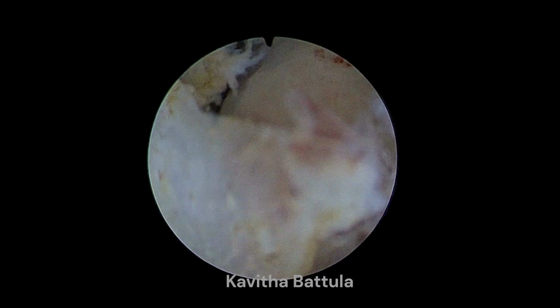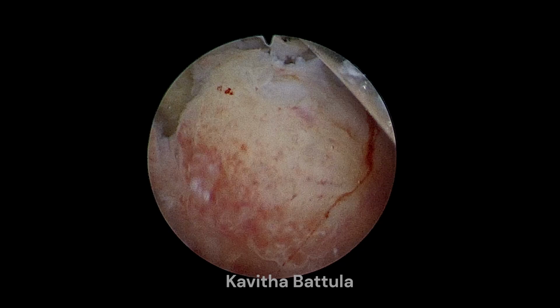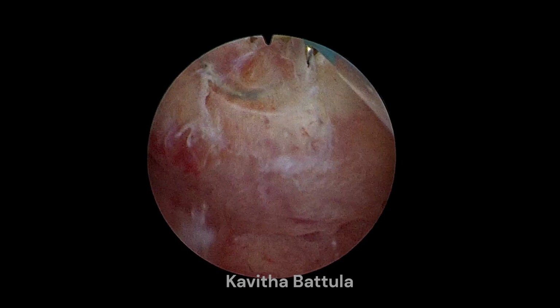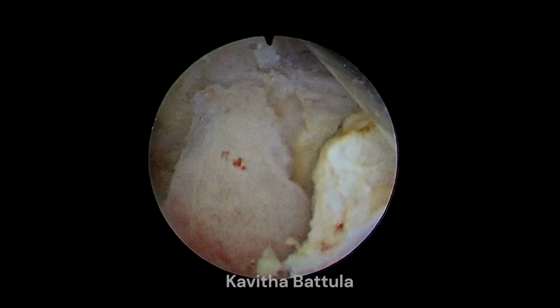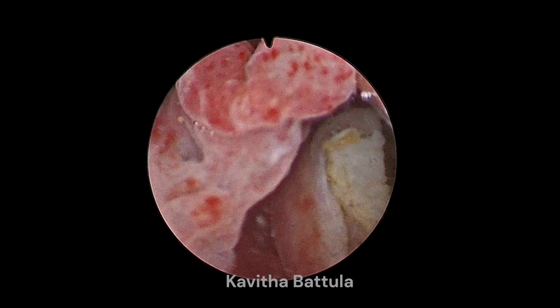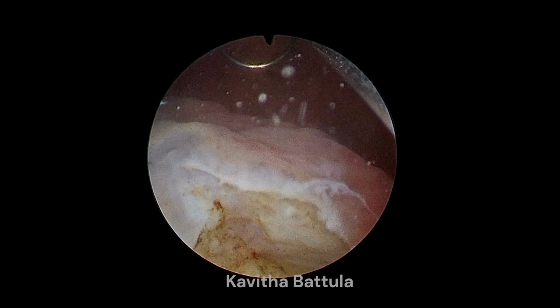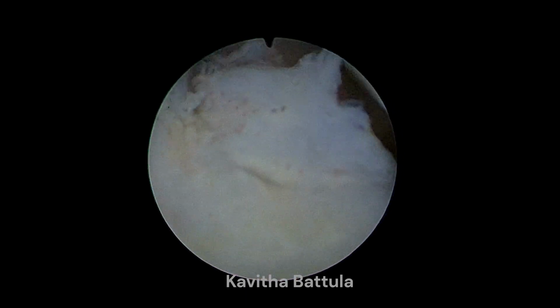When we have to do resection of these submucous fibroids, larger fibroids are more complicated, and any fibroid which is extending into the intramural portion of the myometrium, we have to take care while resecting the base of the fibroid, as there will be larger vessels of the myometrium.